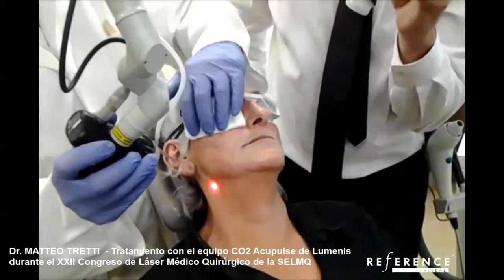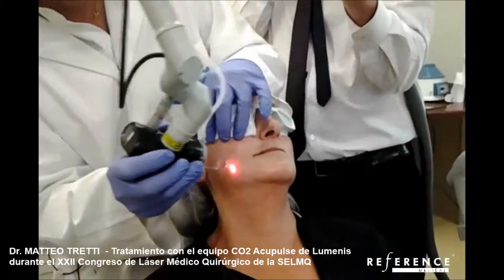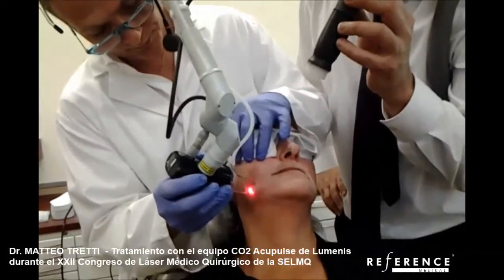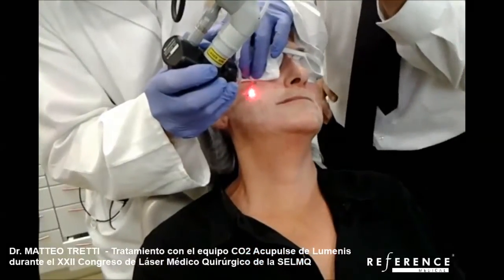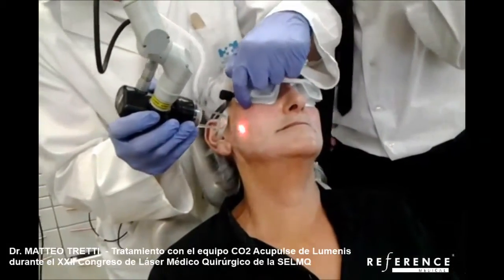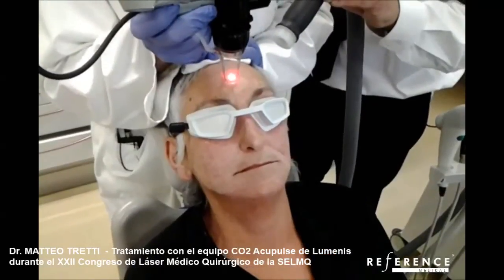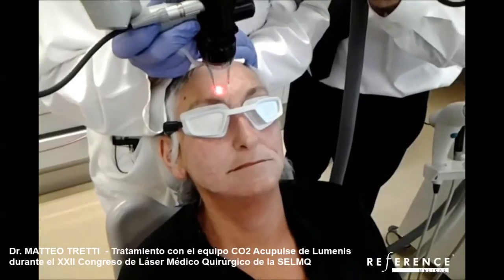I prefer this technique — it is easier to follow the jaw line and we can go very fast. The tip of my fingers are exactly on the orbital bone, so I know where the orbital bone is and I must not pass over. For acne scars, I have a different technique: I try to heat the base of each scar with the deep mode.